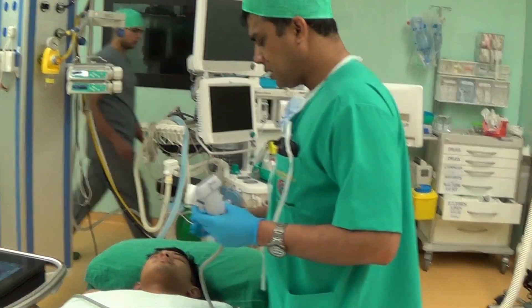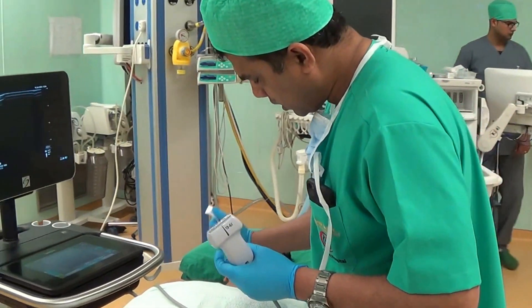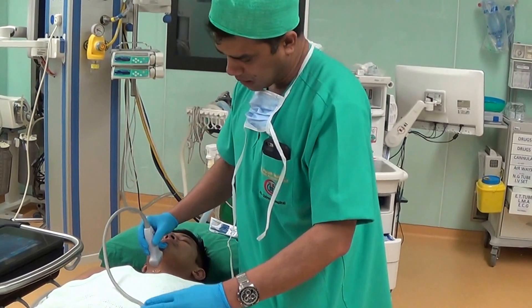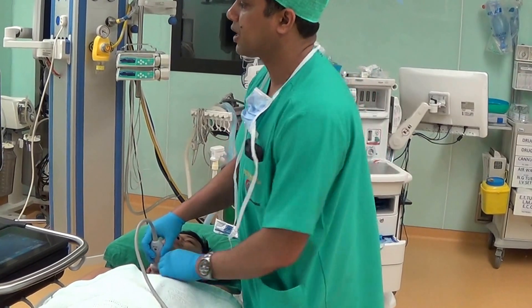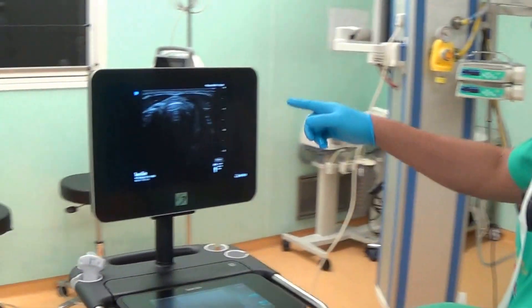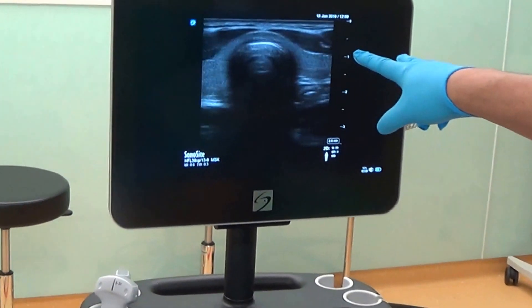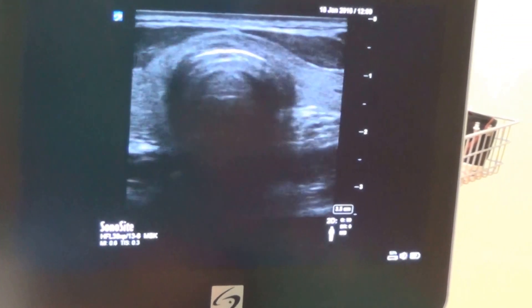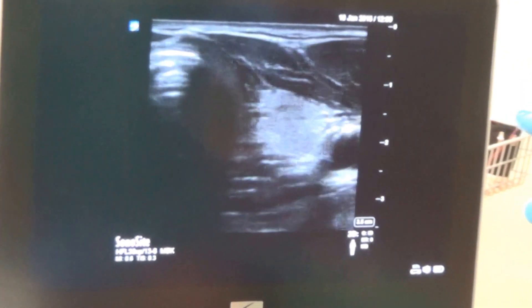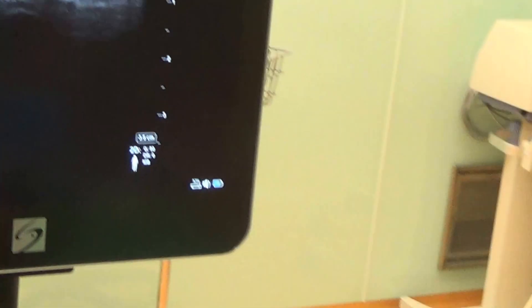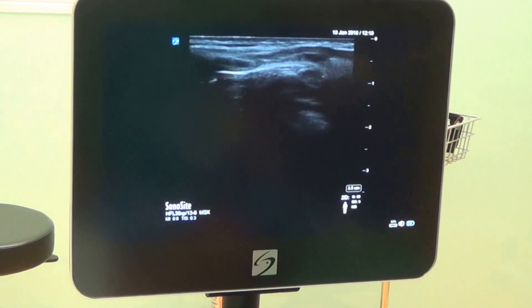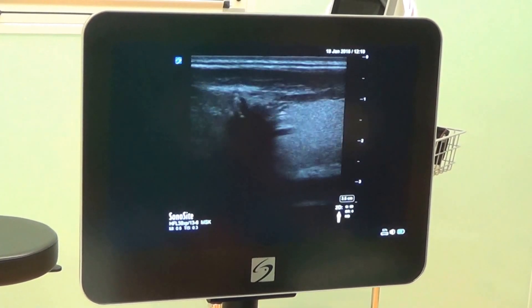The next structure is the cricothyroid membrane, which can easily be seen by examination at the center of the trachea. This is the trachea, and these are all the tracheal rings. You are seeing the thyroid gland lobes on both sides, one carotid on each side. Our goal is to see the tracheal rings and the cricothyroid membrane — very helpful in difficult anatomy or CICV situations.